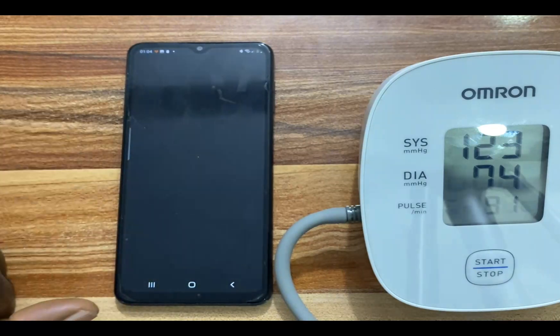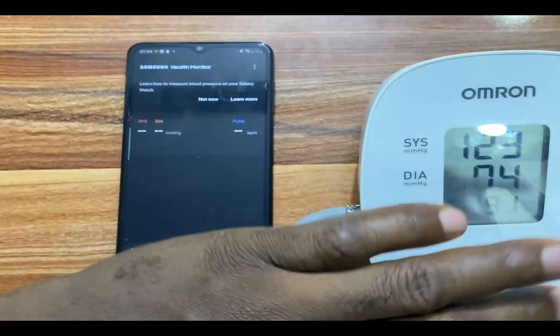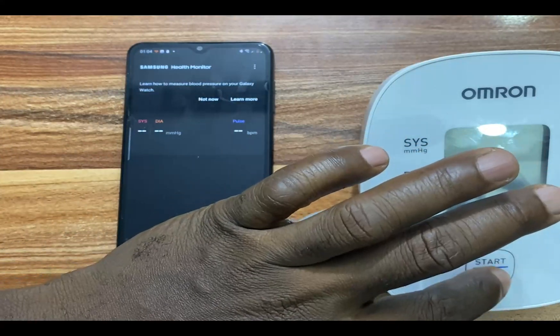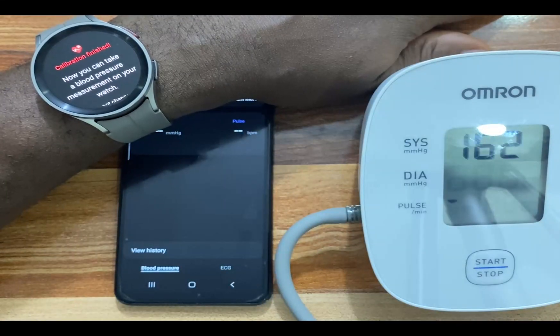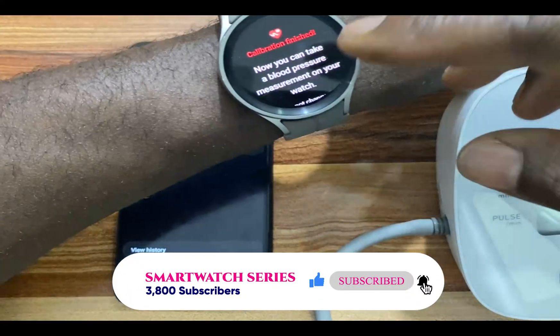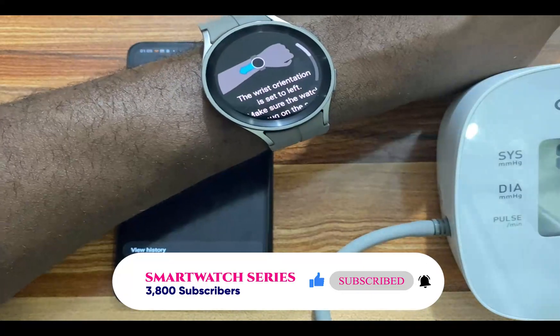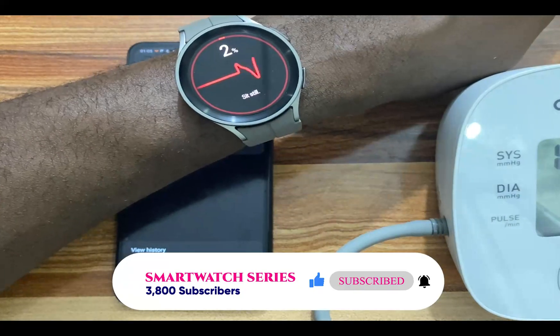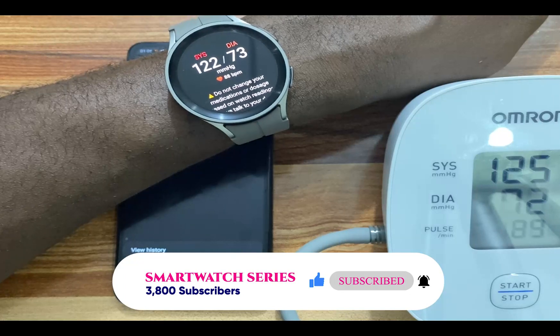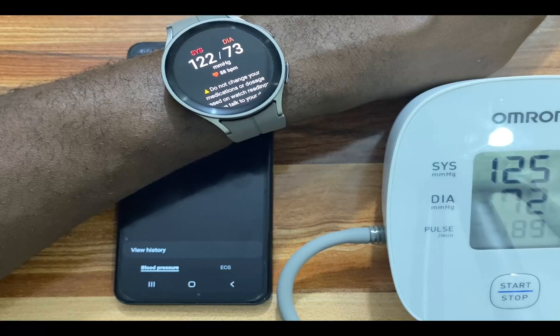Let's see how this goes. I am going to measure my blood pressure here and compare it with that of the Galaxy Watch 5 Pro. We have 125 and 72 from the reference monitor. Now I'll tap on Okay and measure blood pressure on the watch. You can see the results on the Galaxy Watch 5 Pro compared to the Omron blood pressure monitor are almost the same.